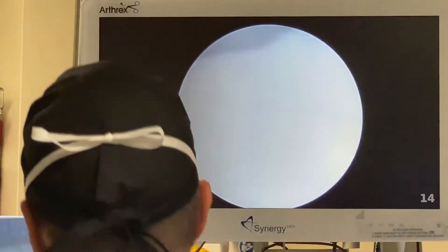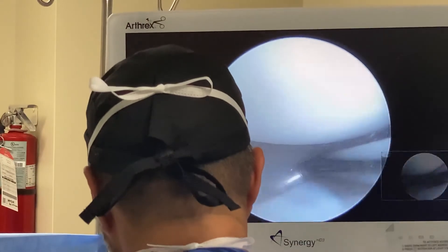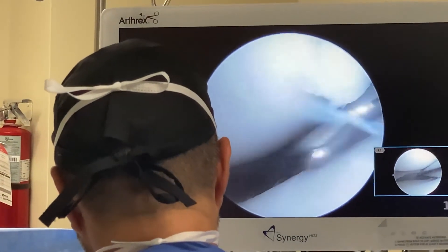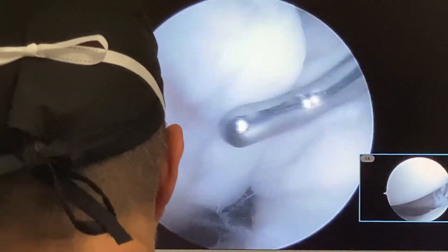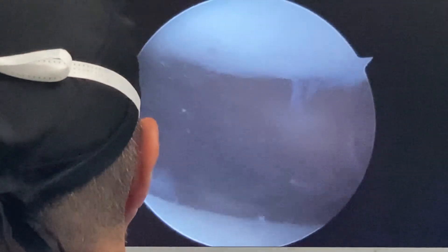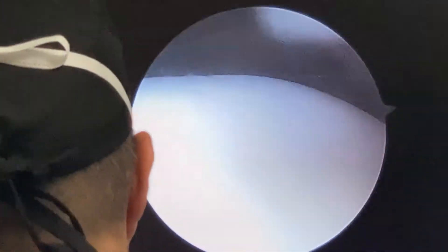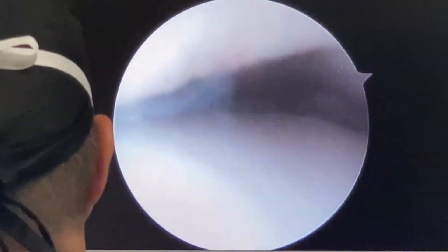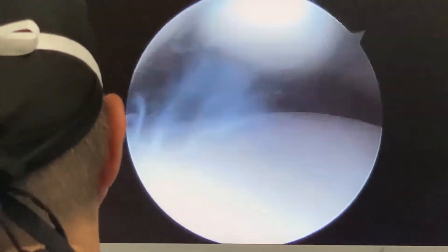One of the beauties of arthroscopy is that it can really be helpful after surgery that a patient's already had. She had her surgery on this side about 10 years ago, to fully assess the surgical procedure that was done and the rest of the structures. The cartilage as well — we see that there's a little bit of damage, not bad. So we'll have to have a conversation with her about how to proceed. I think physical therapy is fine for now, but if she continues to have some buckling or instability, she's going to have to, unfortunately, consider getting a revision ACL reconstruction.